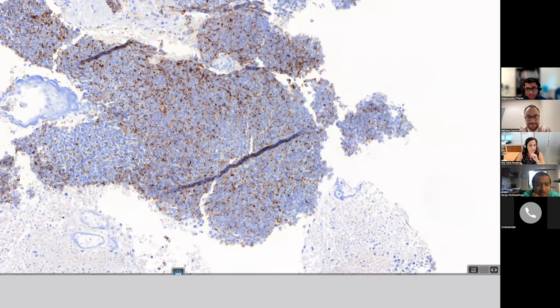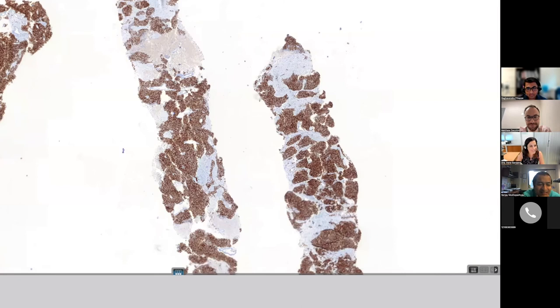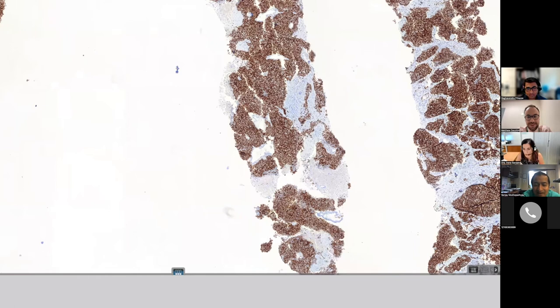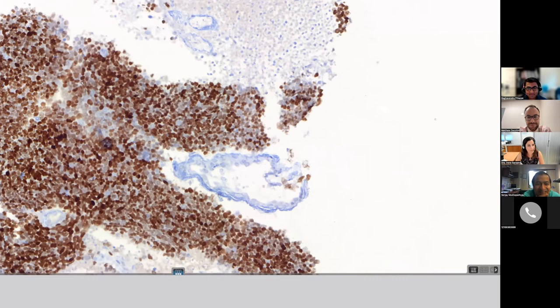And I don't have the INSM, but now I'm doing chromogranin and INSM and TTF1. You can see the azzopardi effect even on the immunostain, because there are little blood vessels with that deposition. Yes, you saw that in the first one. Even here, if you go to high mag here, Irene, there are some blood vessels that are floating off to the side. I mean, you can't see it as nicely as on the H&E, but you can see them here also.